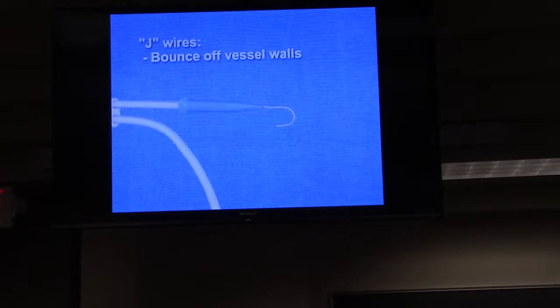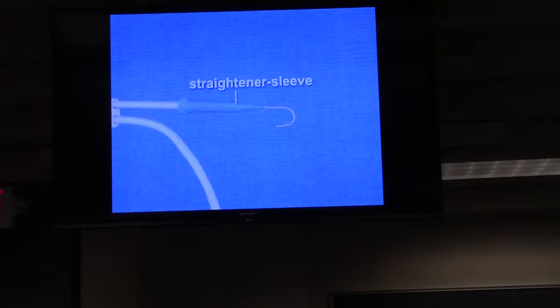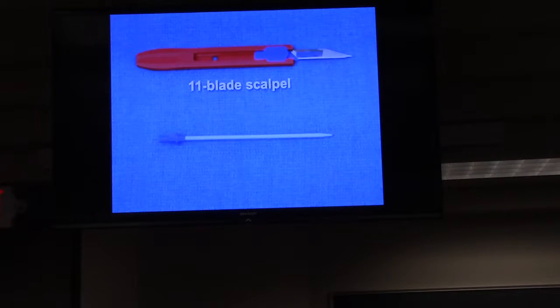Note that the guide wire has a spring-loaded mechanism that creates a 180-degree bend at the distal tip of the wire. The rounded leading edge of such J-wires allows the wire to bounce off the vessel walls, reducing the risk of vessel perforation. Note that the guide wire housing has a straightener sleeve that facilitates the insertion of the wire into the needle hub. An 11-blade scalpel, which is used to make a nick in the skin to allow passage of the catheter through the epidermis. A dilator, which is used to create a tract in the subcutaneous tissues for the catheter.